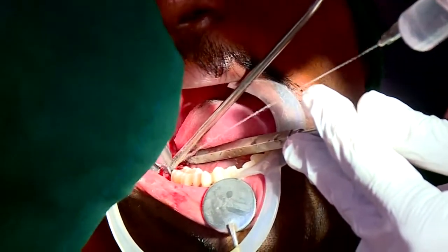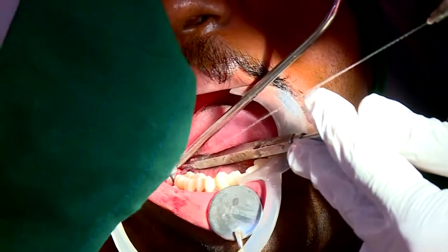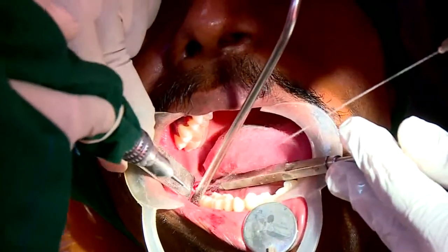Cutting the mesial part of the bone covering the crown. There is more bone.